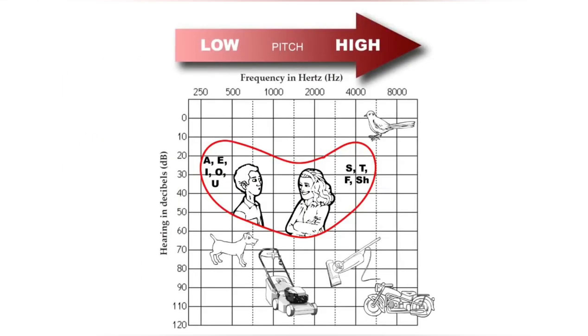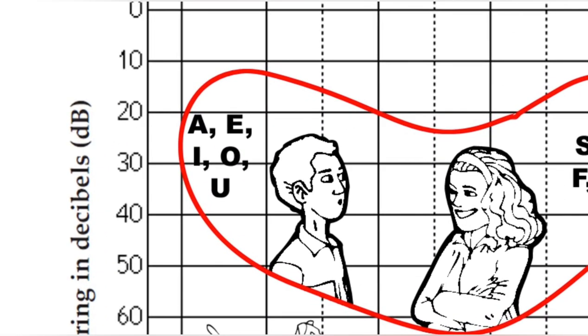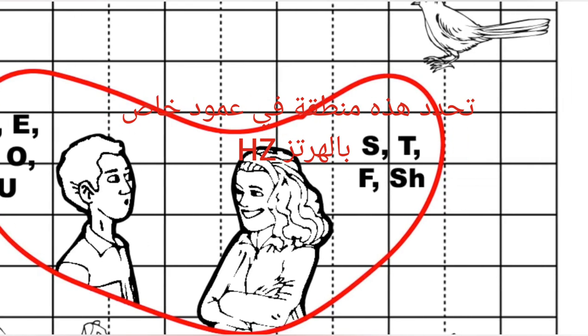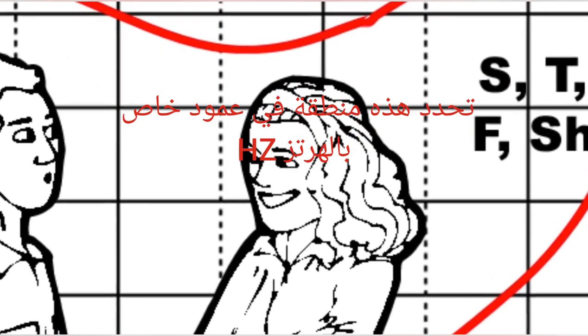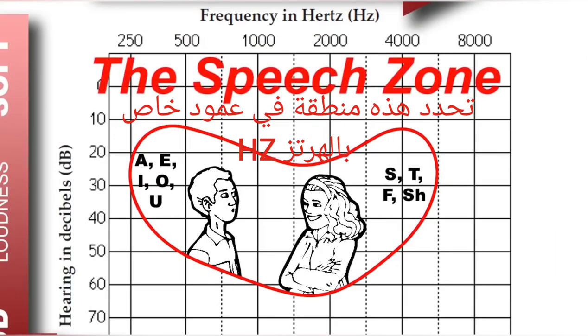Now let's look at the frequency, which runs from left to right. Vowels, such as A, E, I, O, and U, are the lowest pitch and fall towards the left side of the hearing range. Consonants, such as S, T, F, and SH, are higher pitched and fall towards the right side of the hearing range. Oftentimes, these higher frequencies are also associated with women's voices. This section of the audiogram is commonly referred to as the speech zone because most human voices reside within this range of frequency and volume.